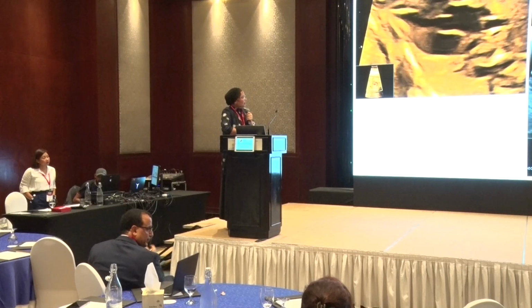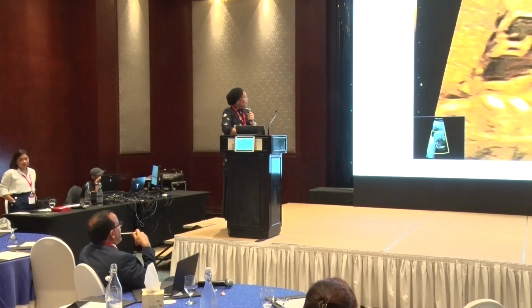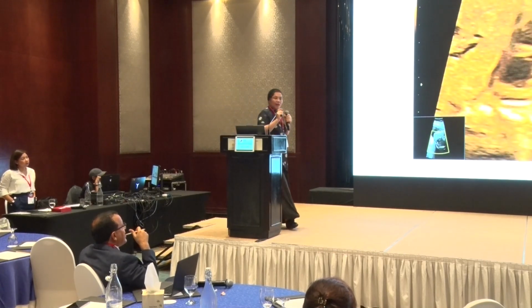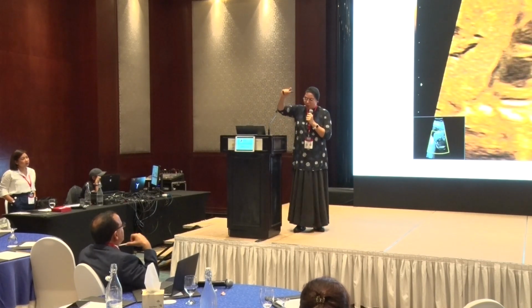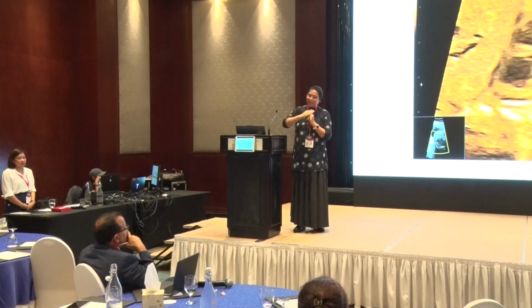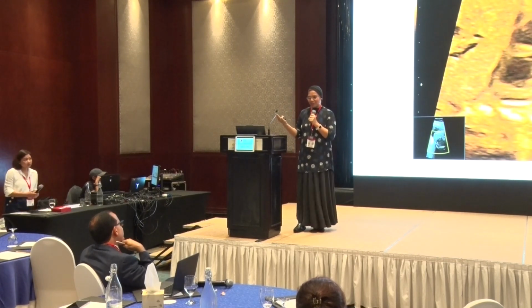But Dr. Suleiman, in this picture, the last one, you could see here that vessel is really dividing into the other. That makes... Yeah. I wish. And that valve, I could not see if there was a valve for the small vessel that is coming from anterior, then it will fit. Actually, on 3 days we reached, the first 2 days I saw her alone, and the third day I saw her with Siham.